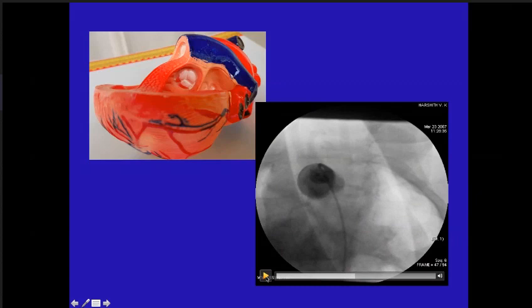Okay. So that shows the coronary artery. Normally the aorta lies behind the PA, isn't it? So which are the sinuses which give the coronary arteries? Left and right, sir. What is the position? Left anterior and right anterior. Okay. What lies posteriorly is what? The non-coronary sinus. You agree? Yes, sir.